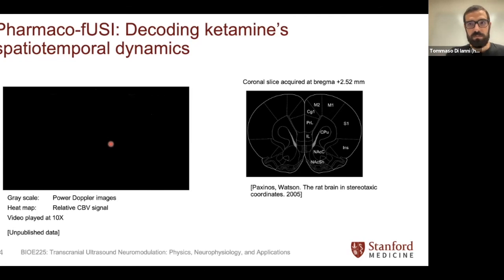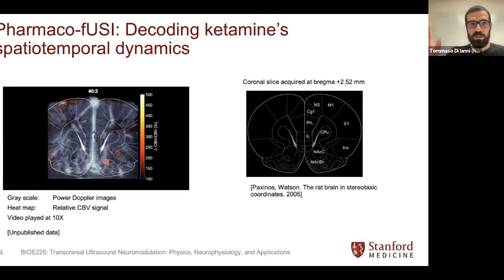And then it usually vanishes by 40 to 50 minutes. So when we go to 40 minutes, you can see that there is almost nothing left, no activation left in the brain. There is some residual, but not specific activation.